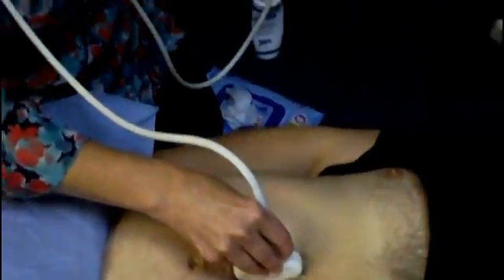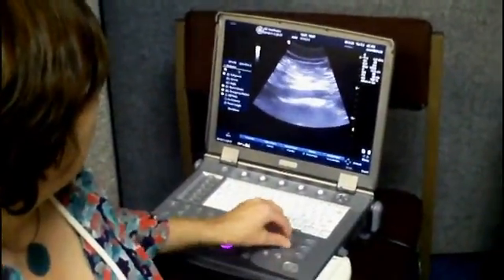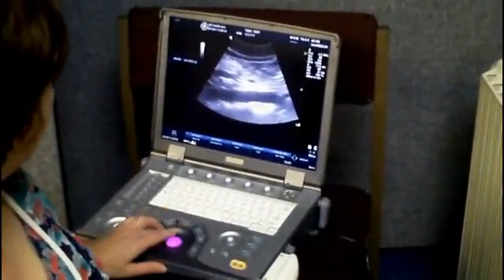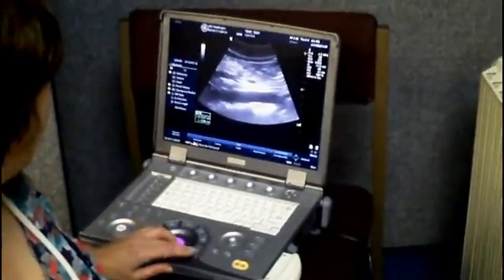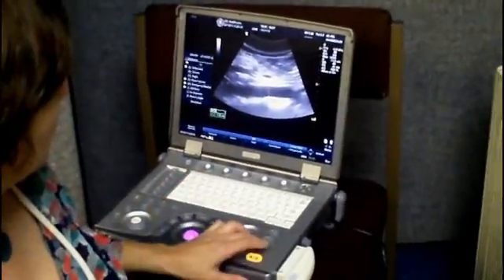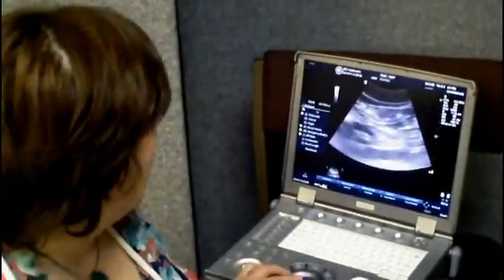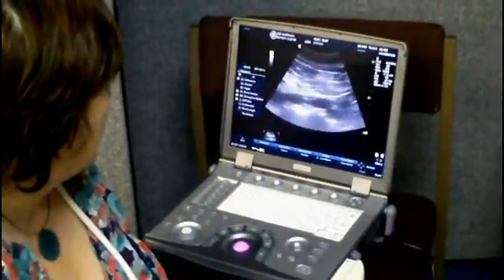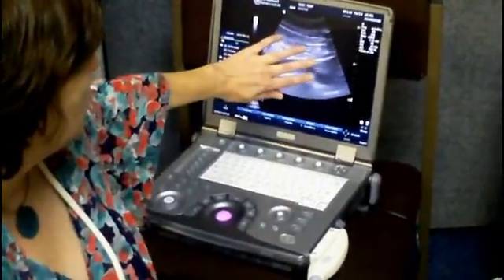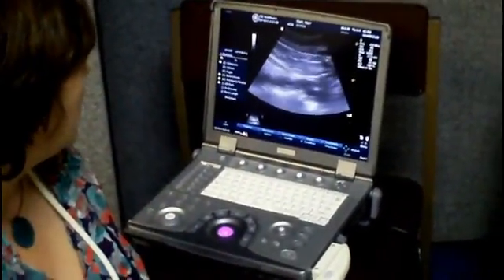If you look here — I'm sorry it's not a big screen for you — you can already see the aorta just showing up. You can see Andrew's too, and all that we would do is take measurements as we go along the length of the aorta, and images that we then have quality-checked at a later date. We go as far down as where the aorta starts to split in two to form the iliac arteries, so it's only a short section of blood vessel that we need to look through.